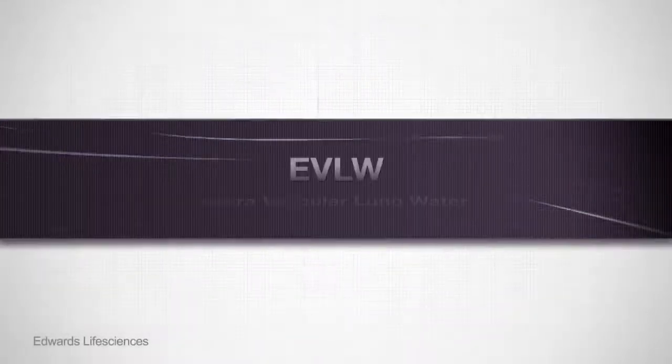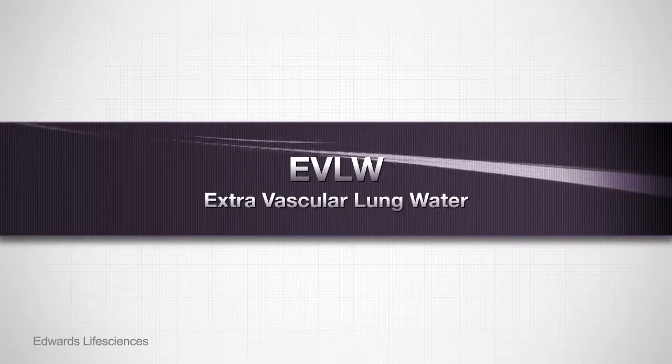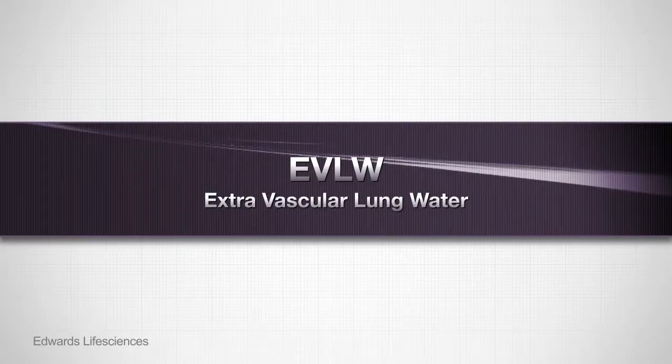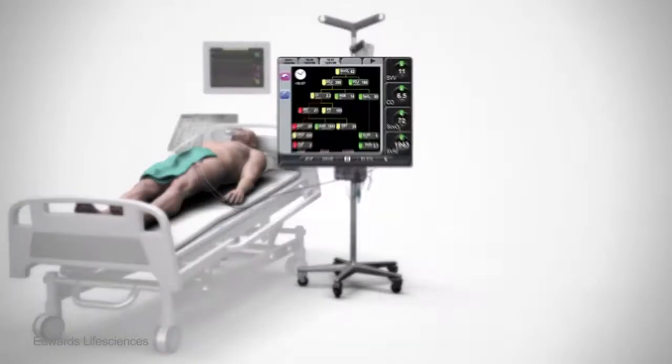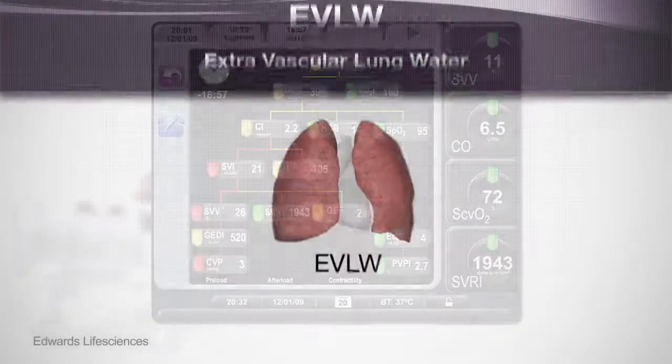In addition to cardiac output, the VolumeView system can calculate the amount of extravascular lung water, or EVLW, which is an assessment of pulmonary edema. This lung water can interfere with the lung's ability to oxygenate blood. Elevated levels of extravascular lung water may be the result of heart failure, volume overload, or lung injury.